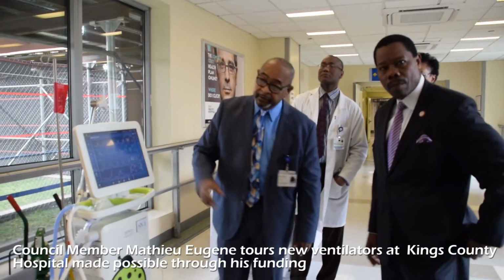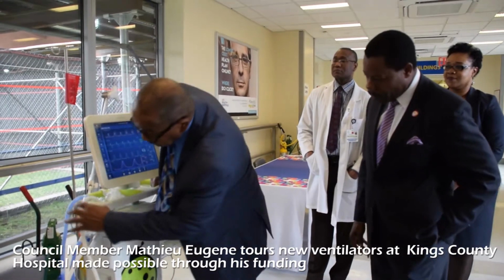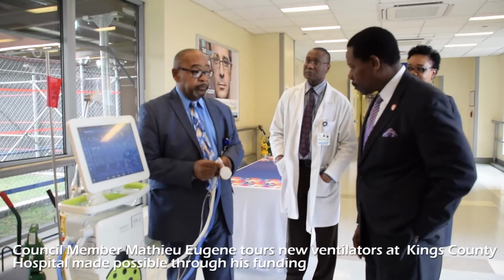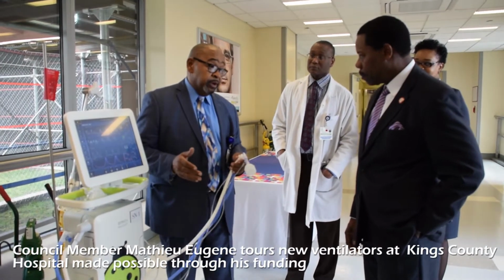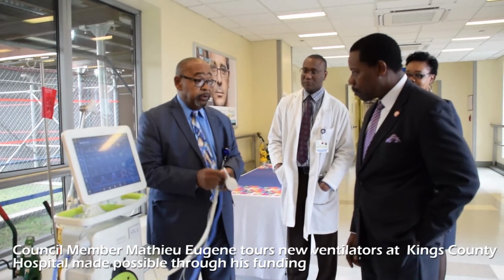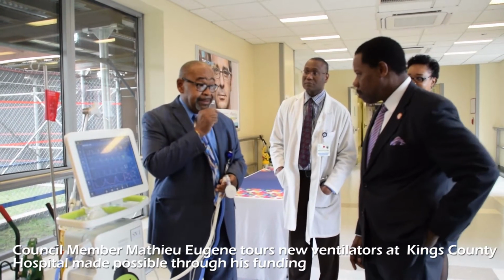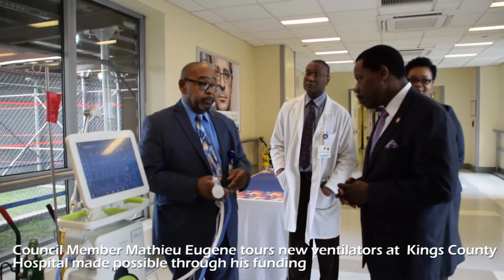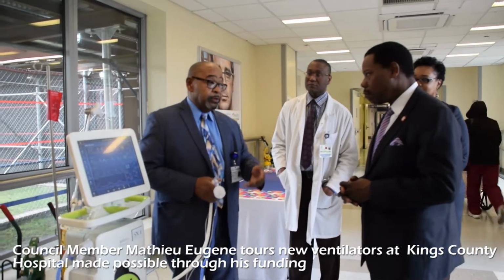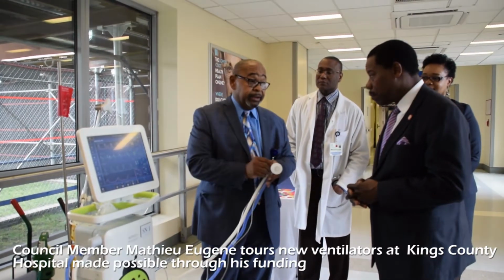That machine over there, as I said, can ventilate any patient. Now, what we're showing you here is a couple of key features of the ventilator. Number one, this is called the proximal sensor. All you need to know about that is this is for the very, very small babies, maybe 500 grams, 750 grams. What this does is allow the baby to trigger the machine. So every breath they attempt to take, they get. There's no wasted effort, because when a baby attempts to take a breath and gets nothing in return, they're burning up kilocalories, and they need those kilocalories to grow. We're going to help the babies grow. That was the whole idea behind this.